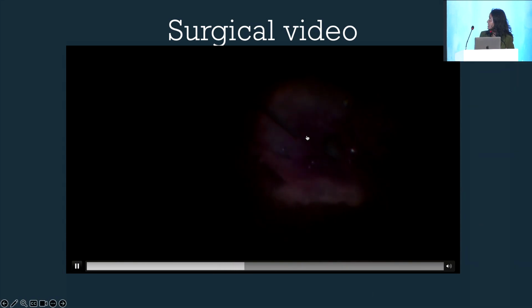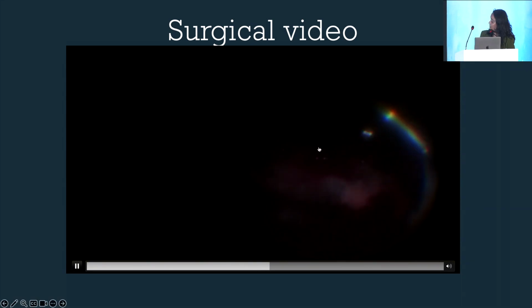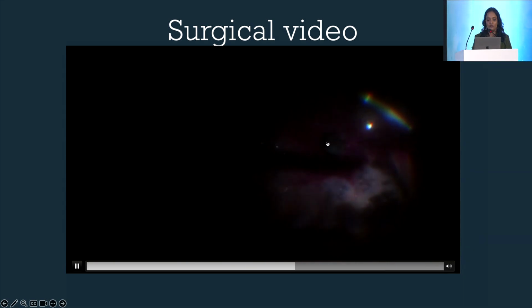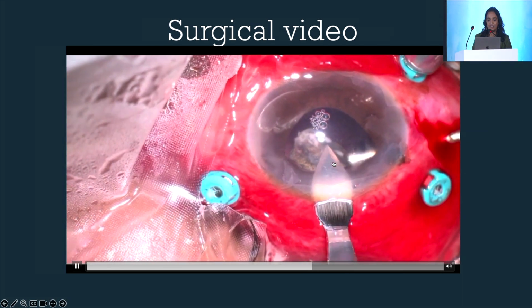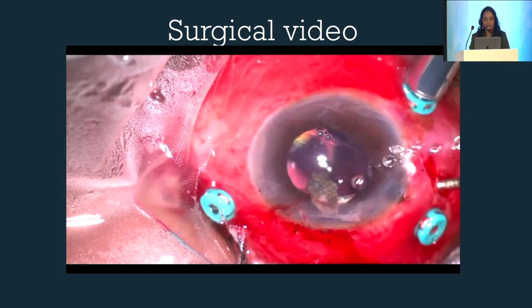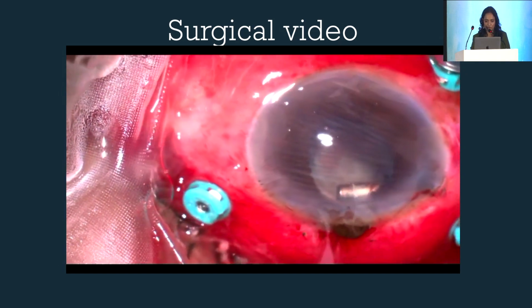And now when I put PFCL inside, the necrotic retina opens up a little, and you can see the prized foreign body right in the center. And I chose to remove all the necrotic retina at the base to reduce the load of infection. Here is the foreign body that is lying right in the center like some treasure. So since the patient was aphakic, I chose the limbal route, made a clear corneal incision, and under visco, I removed it with a handheld magnet first, and at the limbus used an external magnet and removed this foreign body.